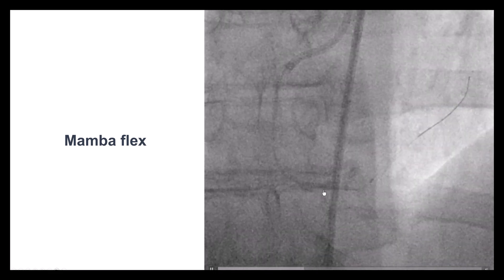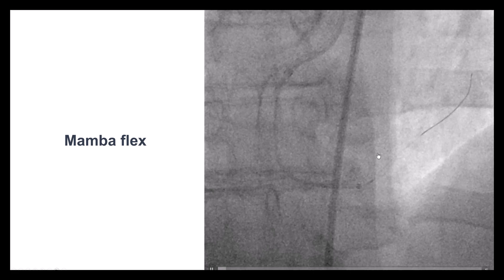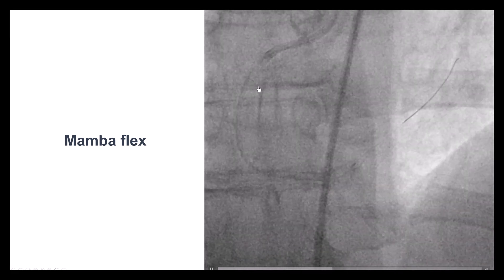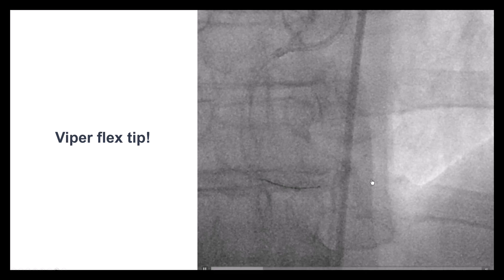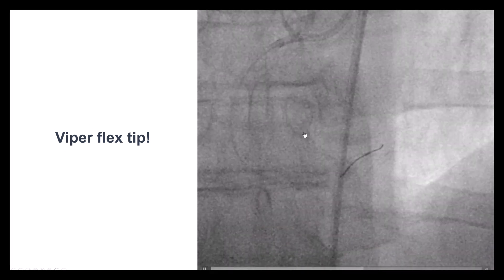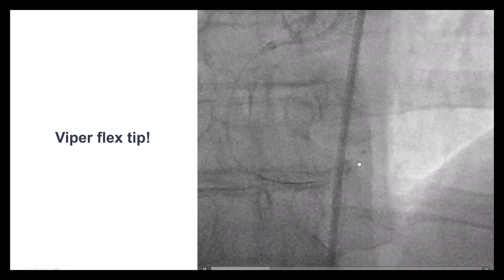We then tried a stronger microcatheter — the Mamba Flex — which has a very strong construction and is unlikely to be damaged by calcium. Eventually, we were able to get through. The guide extension, as you can see, is almost all the way to the posterior lateral. Once this happened, we were able to advance a wire for atherectomy — the Viper Flex tip wire — because it was obvious this lesion was very challenging and delivering anything would have been very hard.